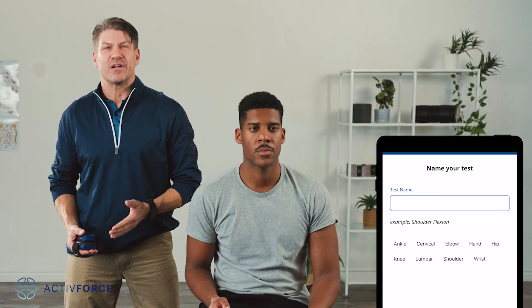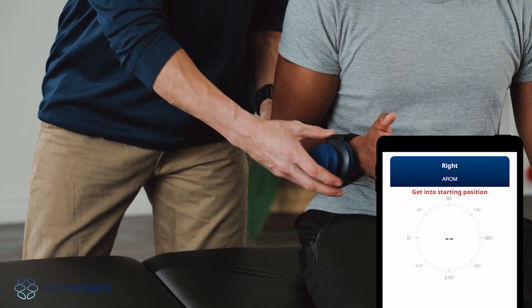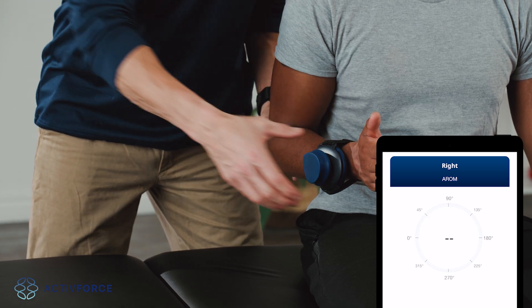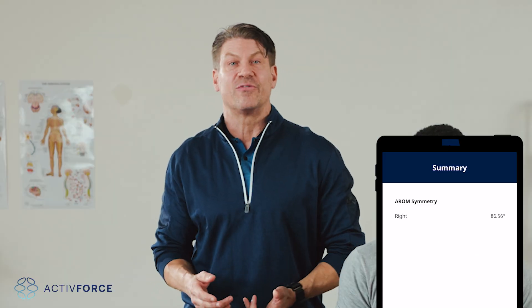Either name your test or skip it and head to the testing screen. With your patient in position, attach the ActiveForce device to the body part you're testing. Hit Start and wait for calibration. Guide your patient's leg or limb through the full range of motion until you reach end range. Now you can view the summary or redo the test if needed. You can instantly save the results to the ActiveForce dashboard or set up again for another measurement.